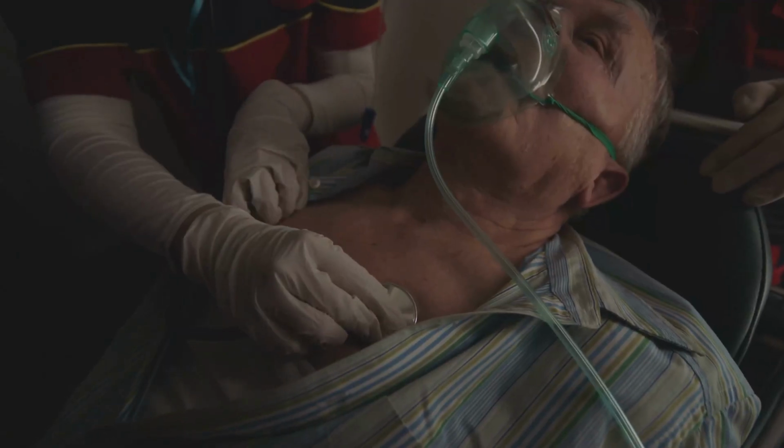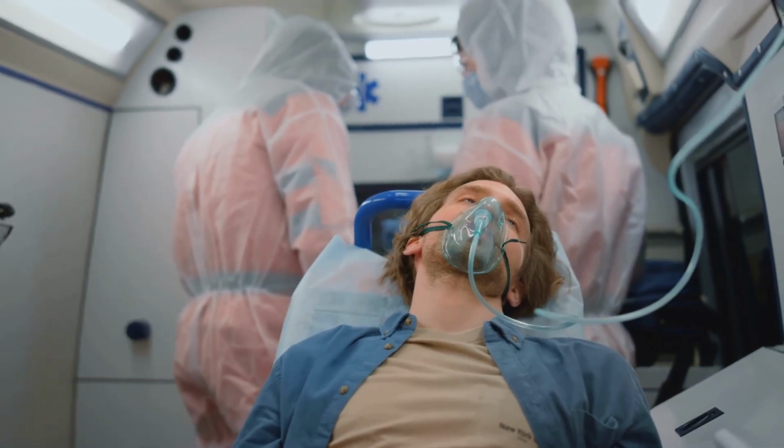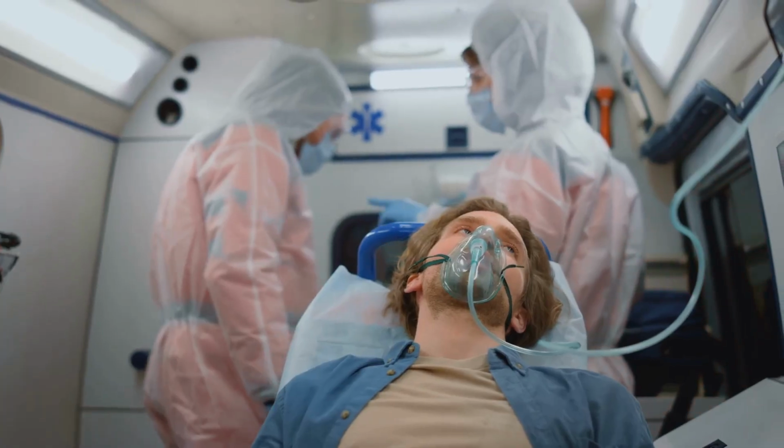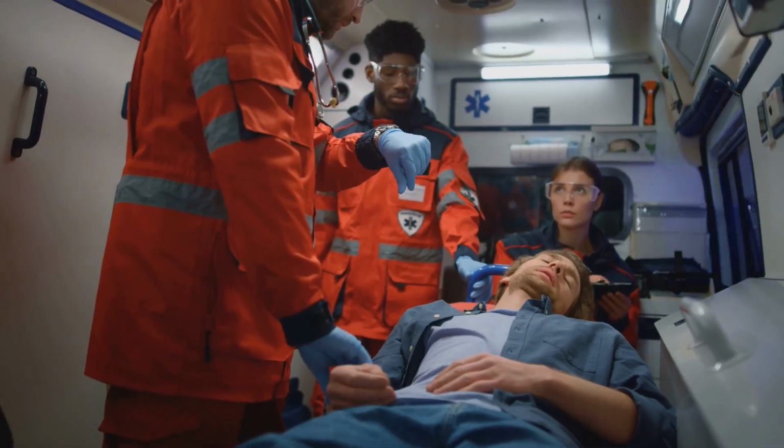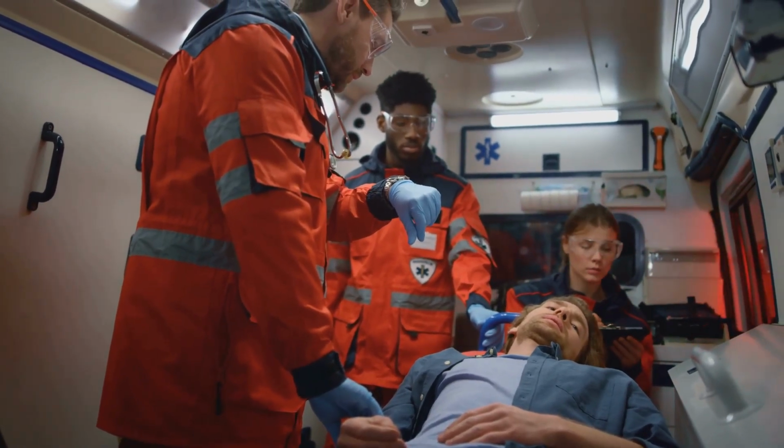Summary: airway management is a critical, life-saving skill. Start simple, escalate only as needed, and always prioritize oxygenation. Maintain spinal precautions when necessary, confirm tube placement rigorously, and reassess continuously.